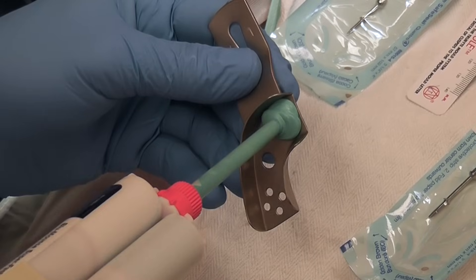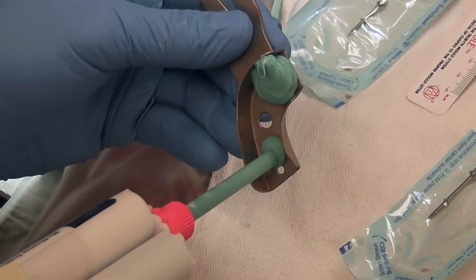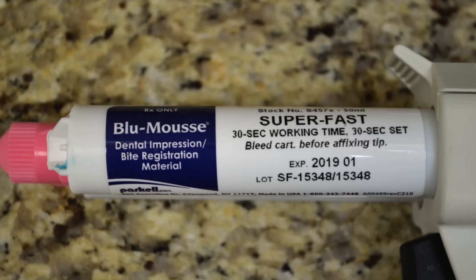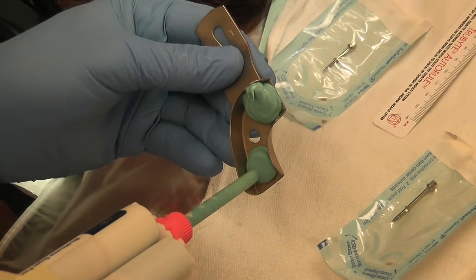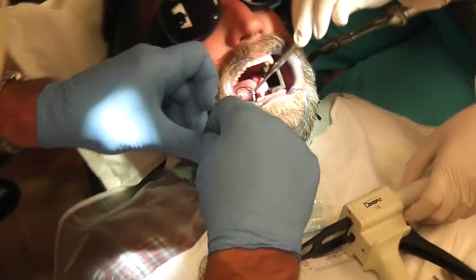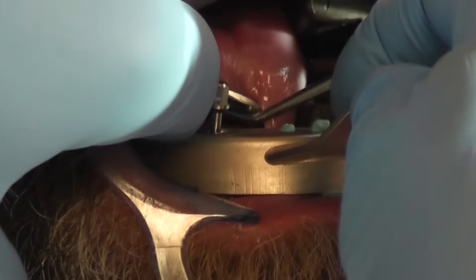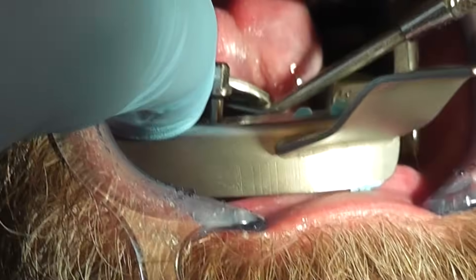Load the suitable Easy Extract impression tray — either left or right — with a fast-setting heavy body type registration material. Only apply the bite registration material on the four dots at each end of the impression tray. Place the loaded impression tray on the tooth row, guiding the extract screw through the center hole.